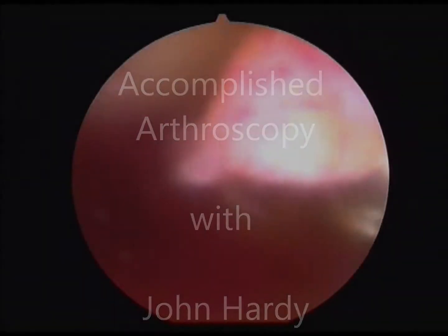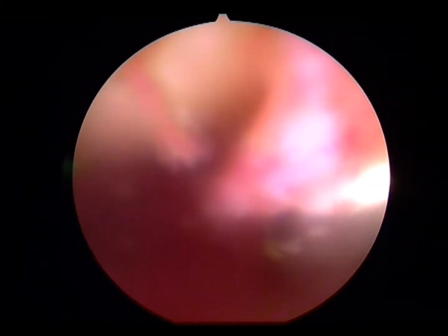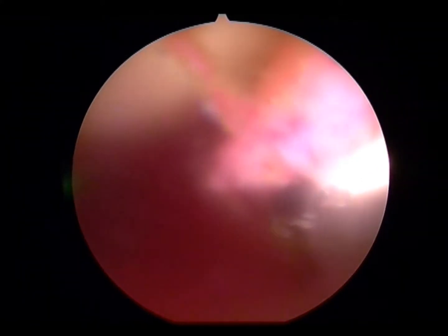My name's John Hardy, I'm a consultant orthopedic surgeon. This is a video demonstrating to trainee surgeons the importance of using both an arthroscopic shaver and the ArthroCare Ambient when performing knee surgery.